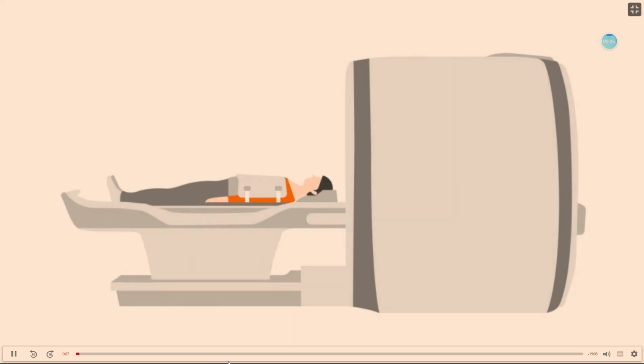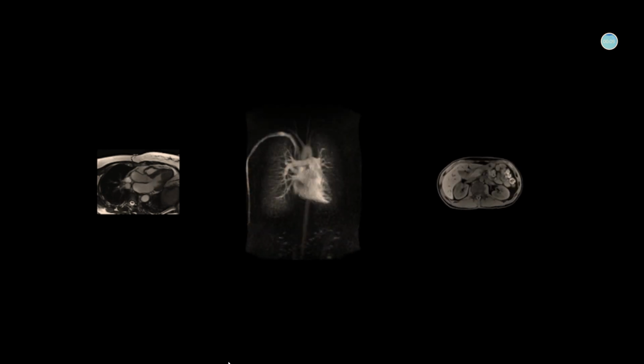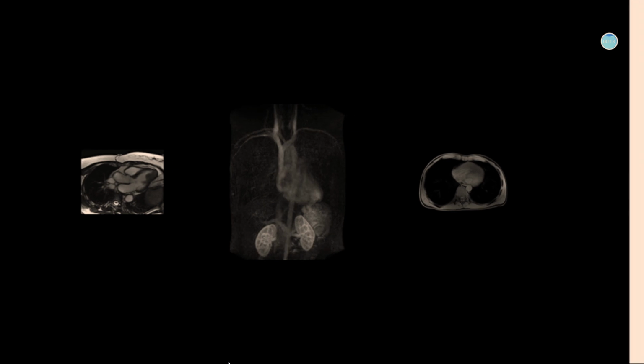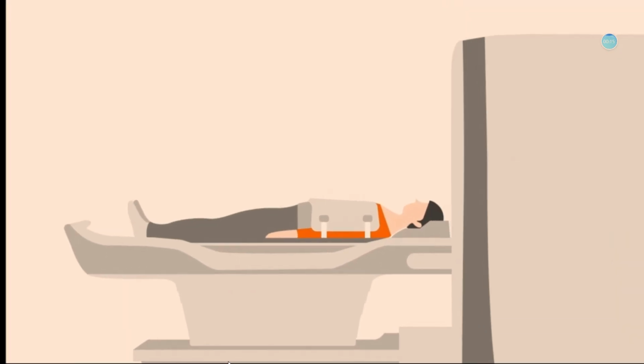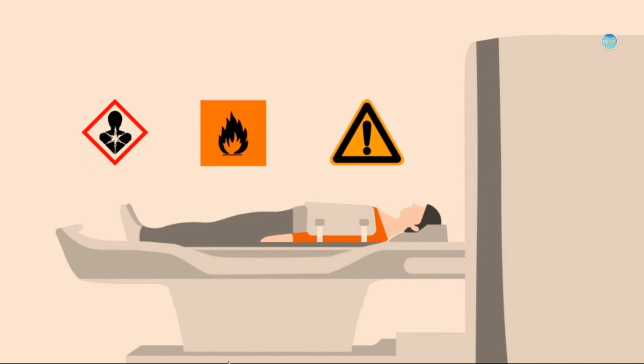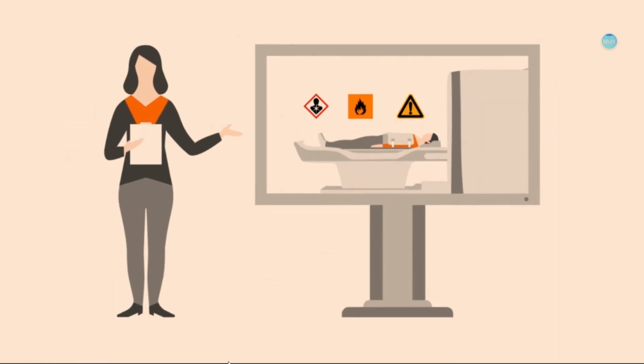MR imaging is truly fascinating. The non-invasive imaging technique delivers unique views of the human body without ionizing radiation. But if safety regulations are not observed, there is a higher risk for danger and accidents to occur. Safety training for all personnel entering the MR environment is mandatory. Such training ensures the safety of personnel and the patients.